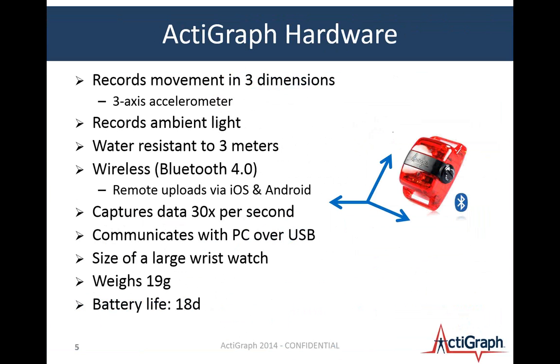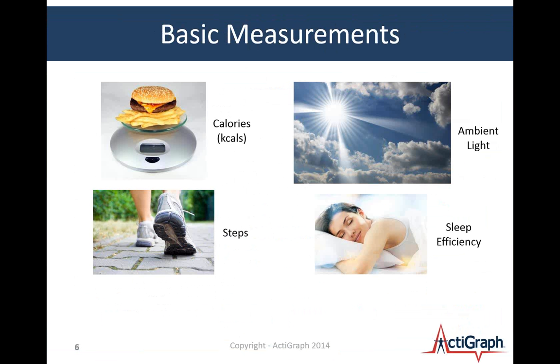For our research partners, the typical battery life is approaching 30 days just because of the configuration, and I'm happy to answer questions about that in a bit. So I always get questions about what does this device measure. So I just put this slide together just to kind of give you some general ideas of basic measurements.